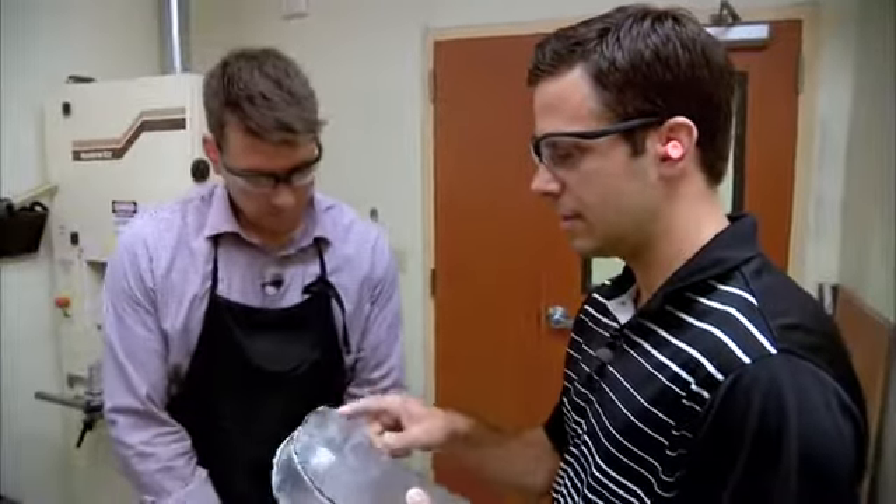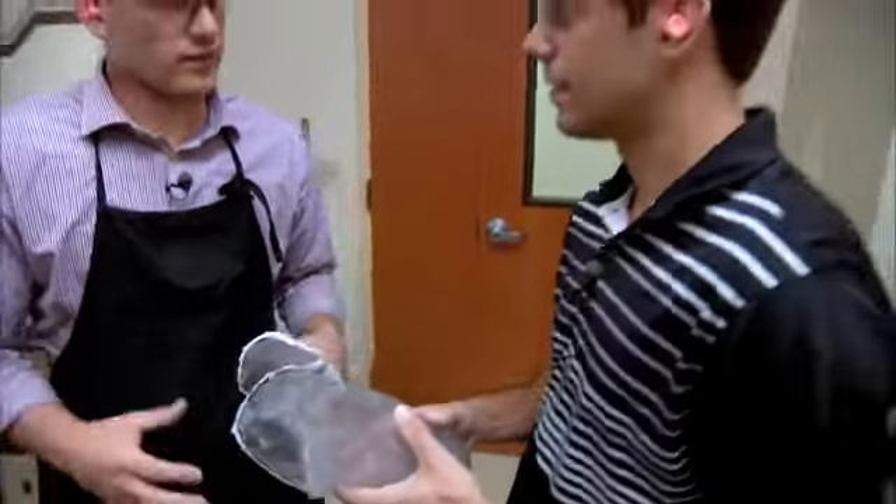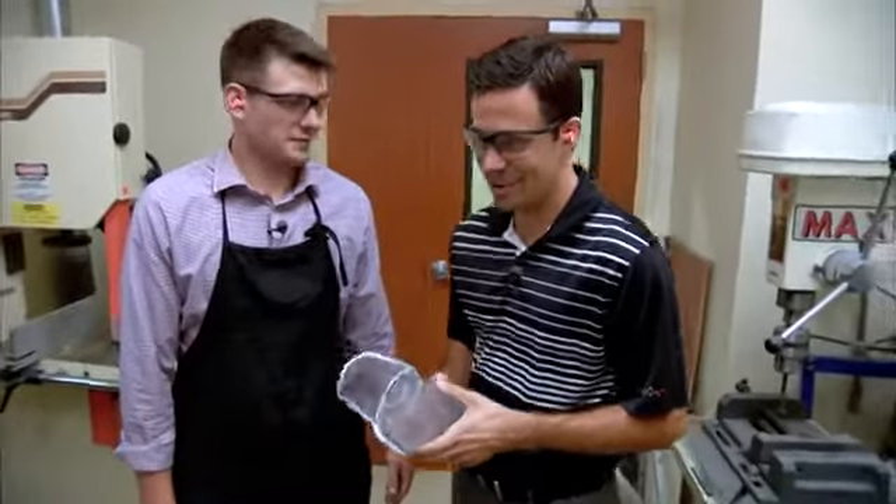We're getting close to the end. The next step is to clean up the trim lines so that we have a nice smooth edge to fit on the patient. Brian asked if I wanted to try, but I said let's leave this one to the professionals — and I've got no problem with that.